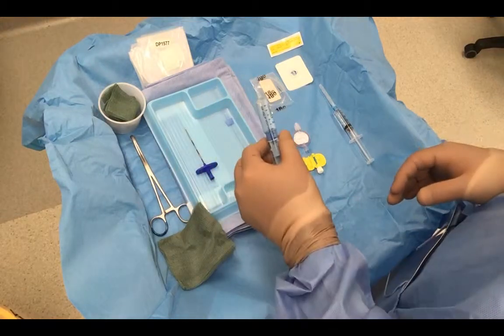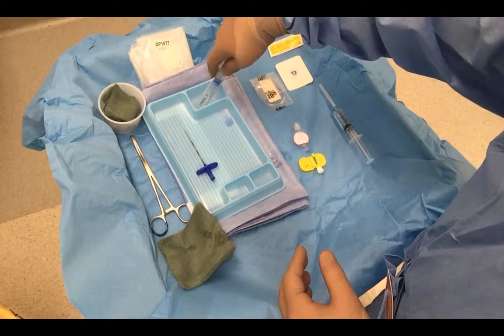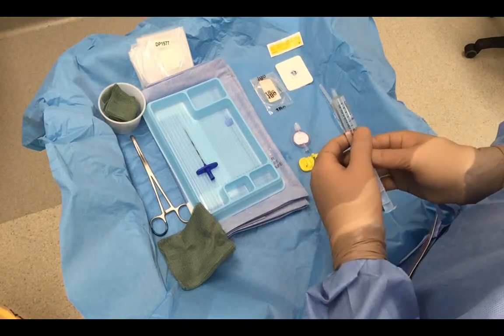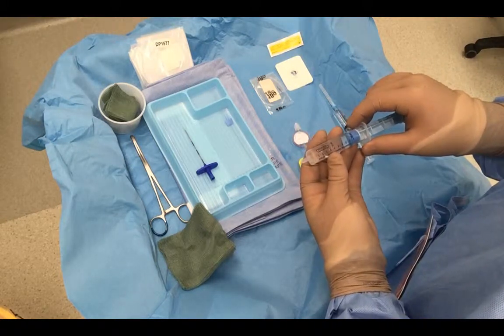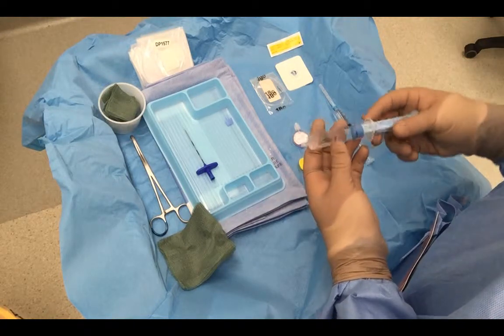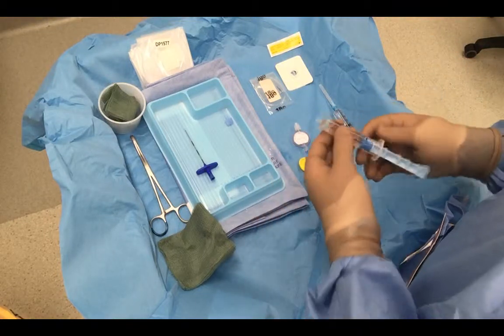So, just drawing up some water. Saline's just as good, doesn't really matter. We want a liquid. Currently, we're doing loss of resistance to saline with this, which is a low resistance plastic syringe. The original technique described a friction-free glass syringe. This is adequate.